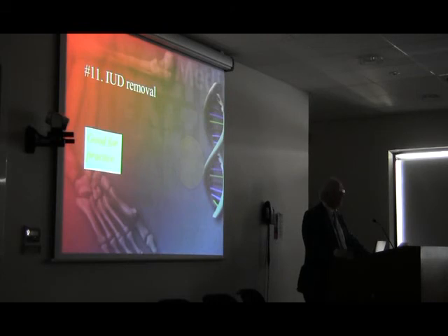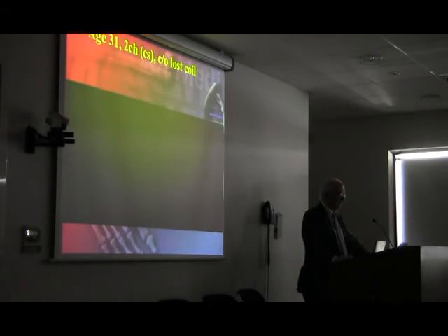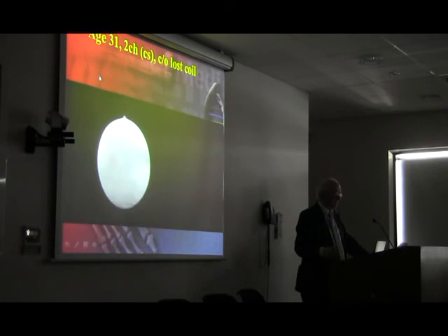Now, number 11 is my last, you'll be glad to hear: the removal of the coil. And I think this is a good one for practice, for something that you want to learn how to use the scope and how to manipulate things.